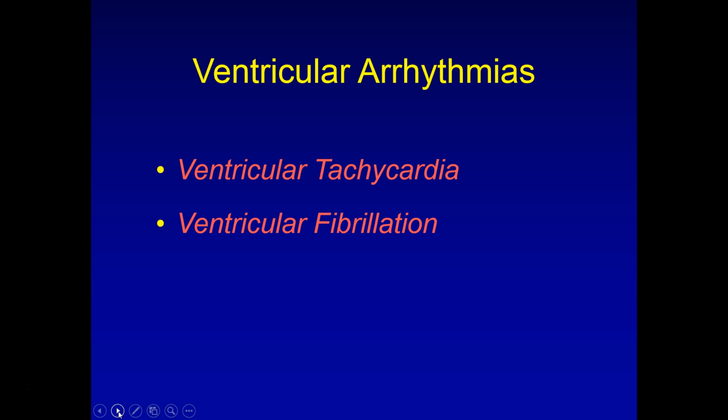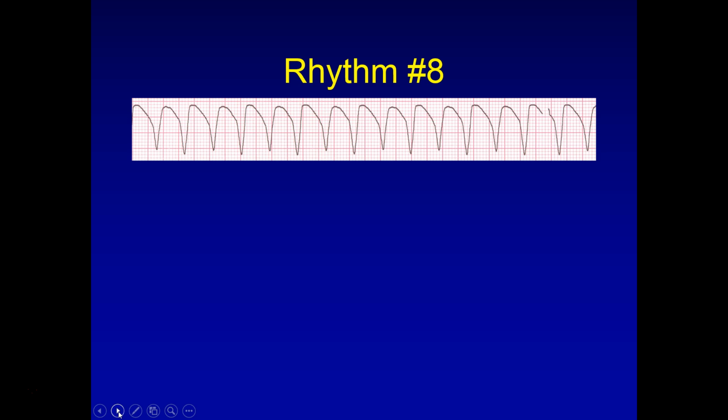Okay, so now let's go into the ventricular arrhythmias. I was teaching a class and asked the question, when this rhythm showed up, does your patient have a blood pressure with this or a pulse? And one of the students said, I don't know, I have to go check. And that's actually the correct answer, because some patients can and some patients won't.